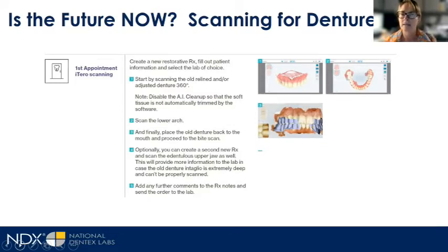Today, I anticipate with the software changes and upgrades that we've seen in the last year, and I'm going to mention one of those here in a moment, artificial intelligence and the ability to turn that on and off, that in the next 6 months to a year, we'll be having a completely different conversation. I mean, it's going to improve pretty rapidly. I think there's a desire for that knowledge in our industry.